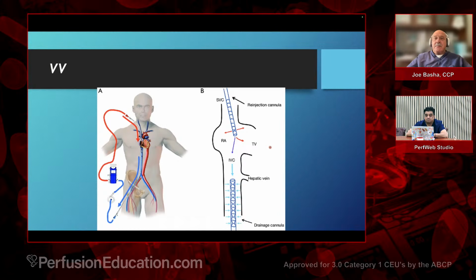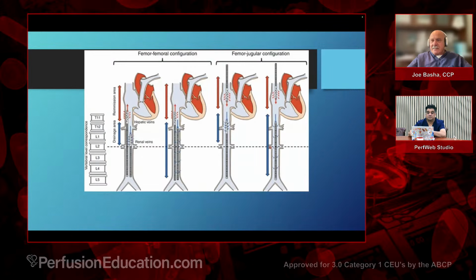So if the patient's base cardiac output is 4 liters and you're flowing 6 liters in your ECMO, easily you can understand you are going to have at least that percentage, roughly 20%, recirculation just from that, even with perfect cannulation. Does that make sense? Makes sense. Okay, good. So here are the various different cannulation techniques.